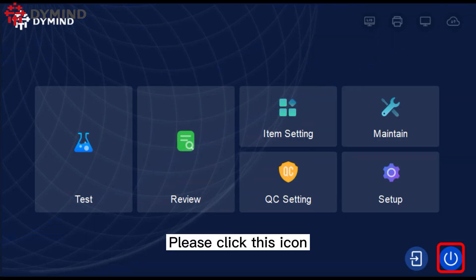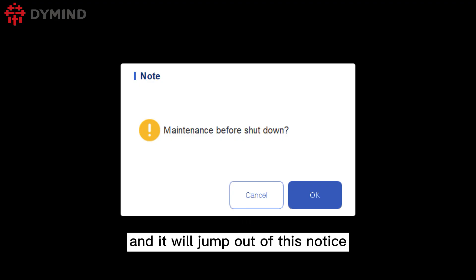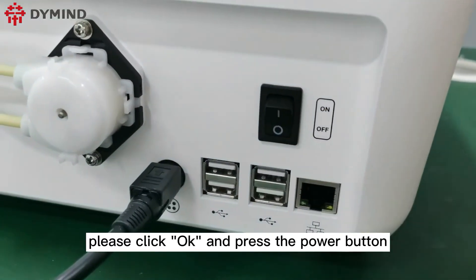Please click this icon and it will bring up a notice. Please click OK and press the power button.